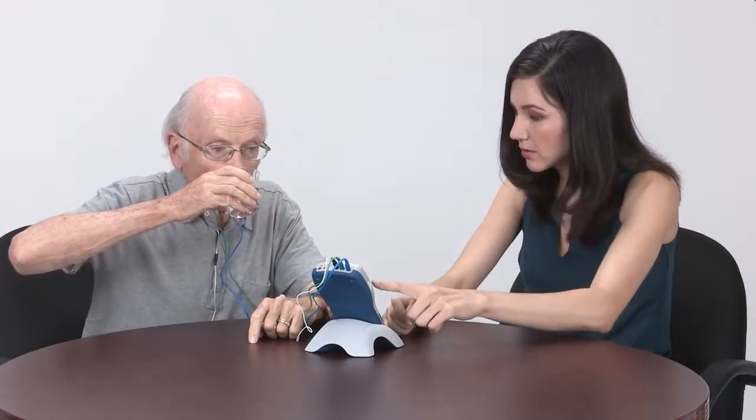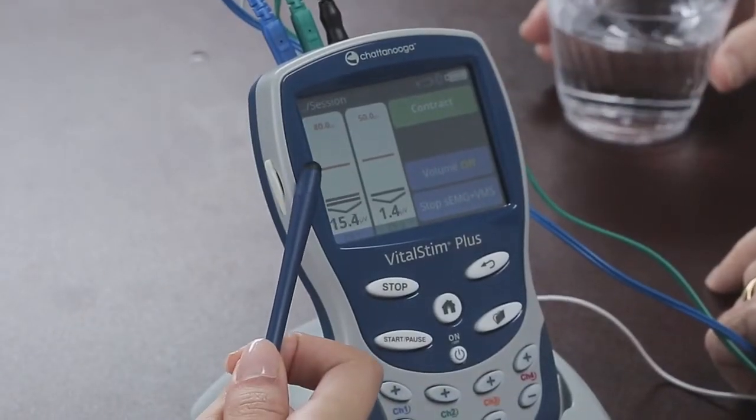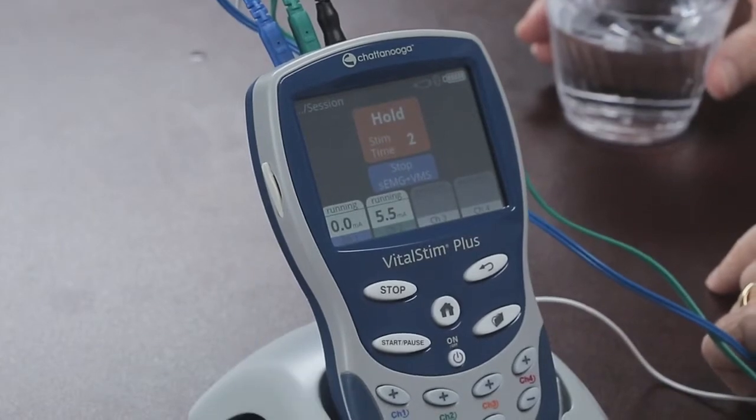When you reach the threshold, hold it and hold it and hold it for the right amount of time. Once this is done and executed, the patient repeats this cycle as many times as is therapeutic. And this concludes this video tutorial.